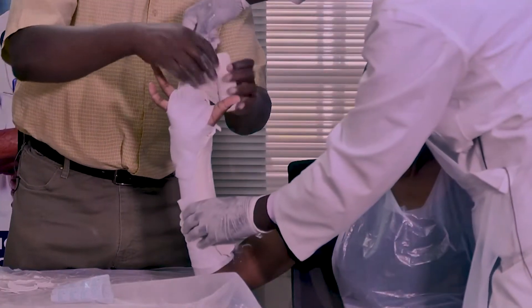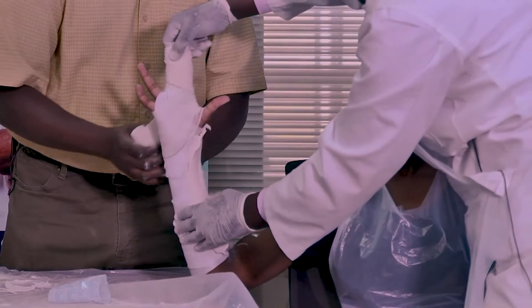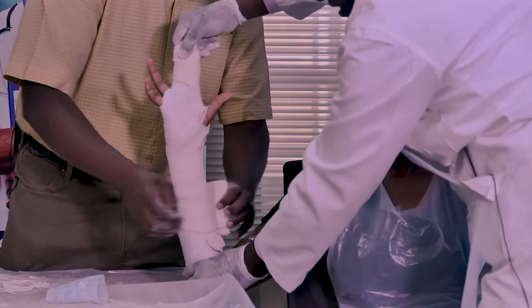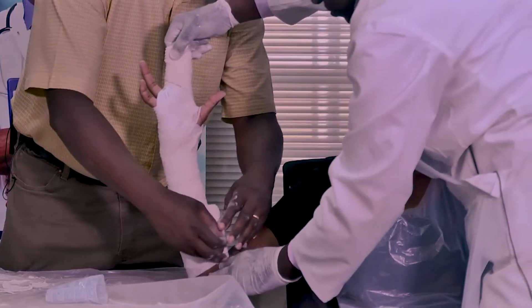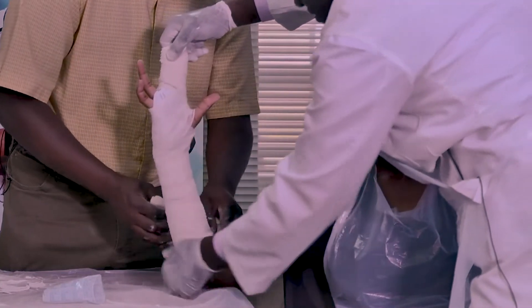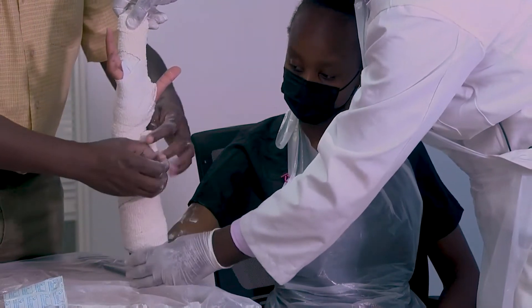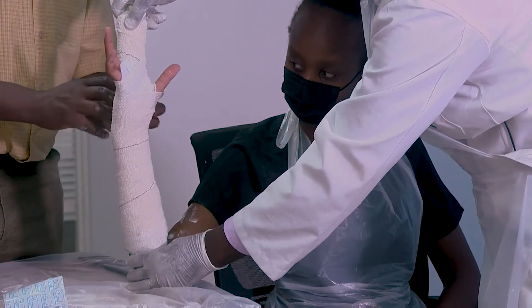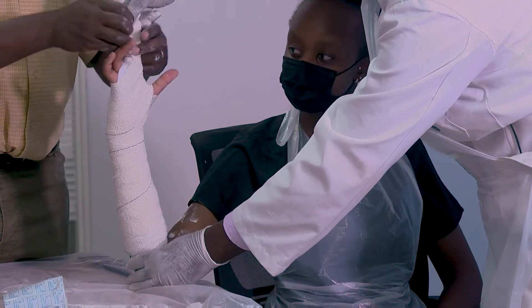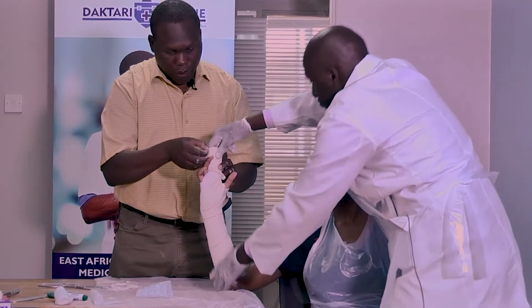Now secure it with a crepe bandage, following the same procedure — 50% overlap, not too tight, not too loose, because there can always be complications. An assistant is very important; you can see we are holding the hand to prevent movement. Then come distally again, following the same 50% overlap. I am just going over it — not tying it tight.